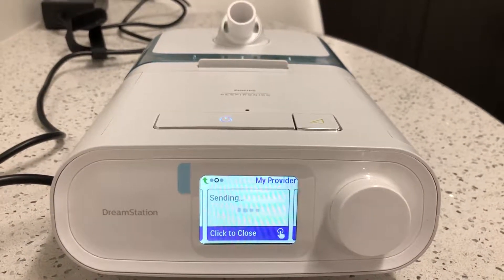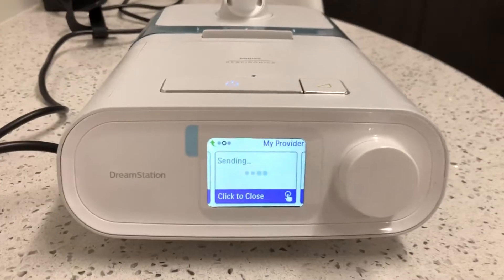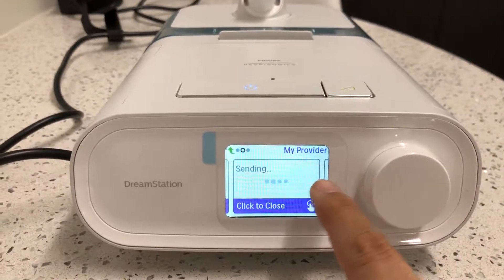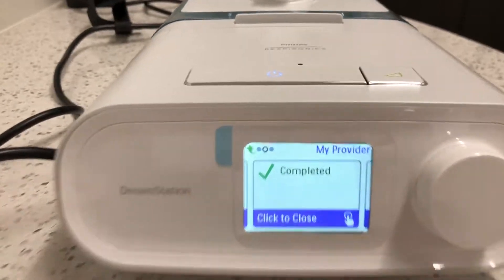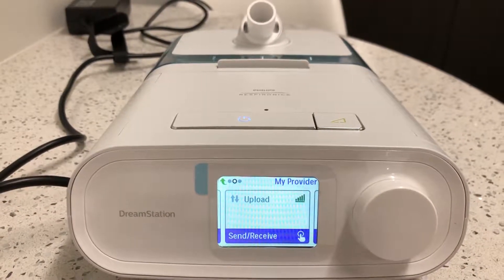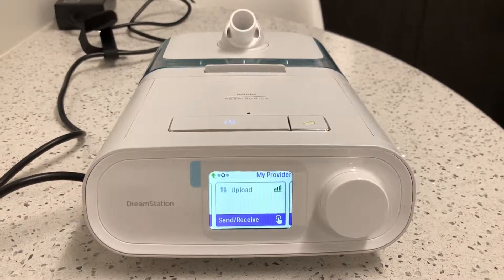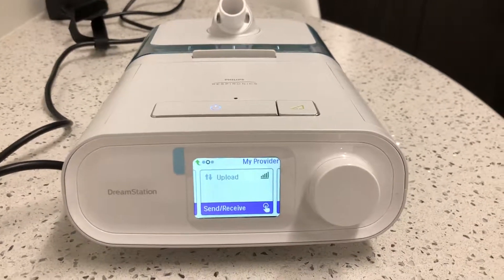This will typically happen within 24 hours, but if you want it to happen the same day, you just go over here and follow this. It's going to take about a minute — there we go, it shows 'Completed.' You click close, and now your machine will be updated with any changes that we've made on our side. Hopefully that helps you — thanks and have a great day.